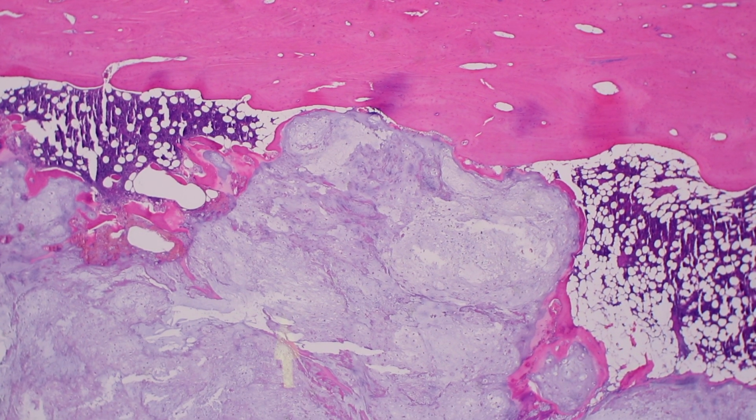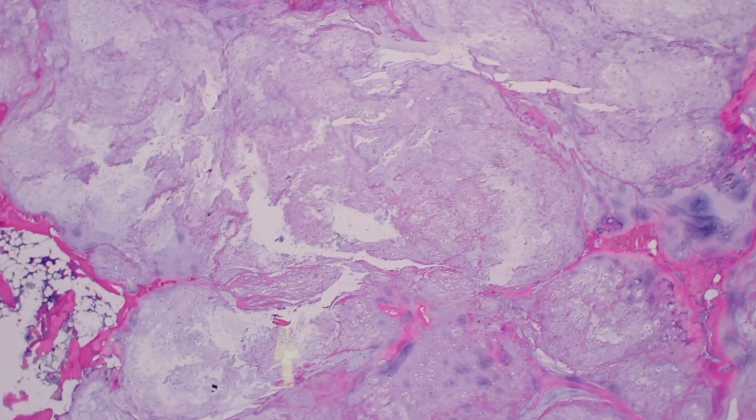So here we're looking at a nodule that's well circumscribed, and all the underlying bony trabeculae that were once there are gone. That means this tumor has grown slowly enough that there is osteoclastic activity resorbing all the bone that was once there. Rapidly growing tumors grow so quickly that they grow faster than the osteoclasts have the ability to form and remove the bone. And so the bone persists while the tumor continues to grow. It replaces the marrow and then entombs the bony trabeculae.